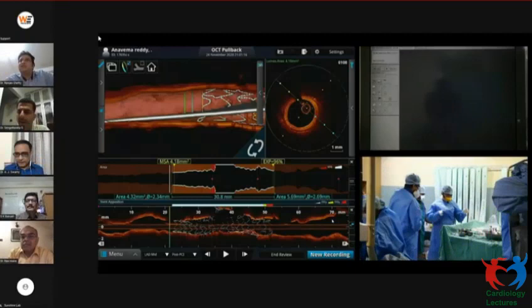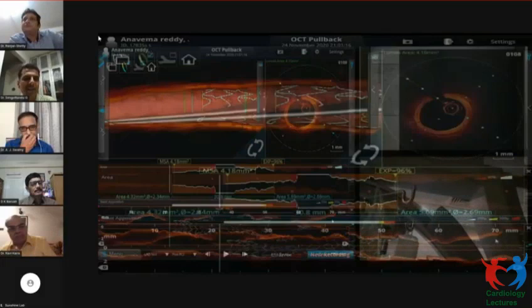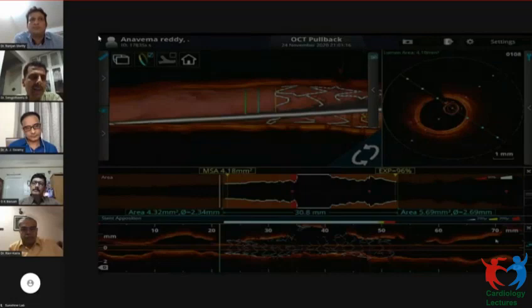There's one, Dr. Sangatuvelu, where the question is, in left main bifurcation, do you prefer to keep the main stent to the ostium of the left main? Okay. See, it all depends upon the length of the lesion, the length of the left main. Generally, we try to cover the ostium because it's going to be a very short segment. And we need to consider, when you do a POT, we need to have sufficient length proximally, at least 8 millimeters. So, considering all that, we generally want to stent the ostium. But if you have a long left main and you have a disease-free ostium, and quite a length of disease-free left main beyond the ostium, I think we don't have to always stent the ostium. So I think that should be fine.